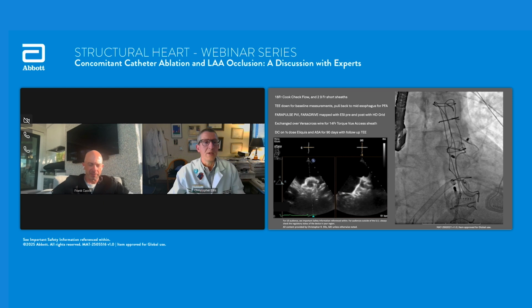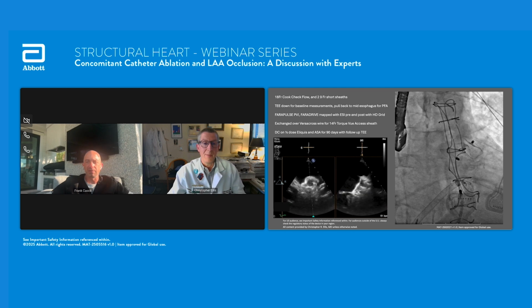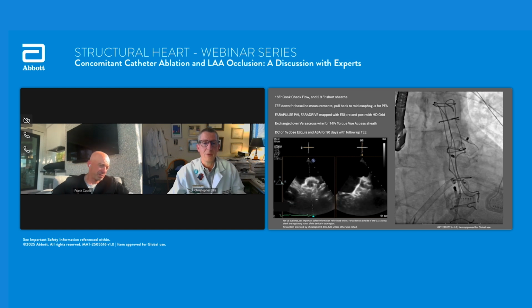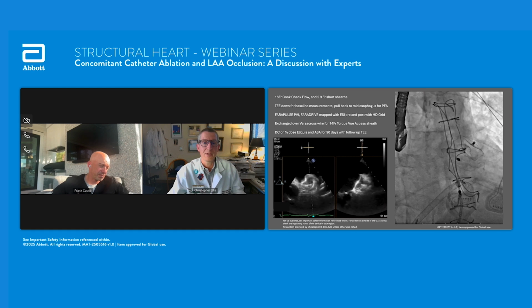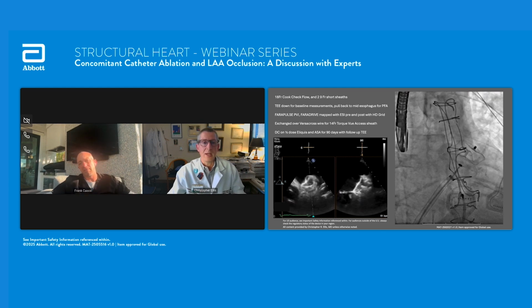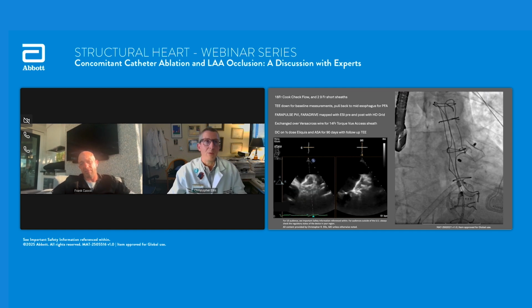I do really like the idea of getting all of the ablation done before you close the appendage. The big reason is, in my mind, let's say you work in the LA, you close the appendage, you go to the RA, and you get some ridiculous flutter that you have to cardiovert the patient for, and you've already released your appendage closure device. It's really not an ideal situation. You would like to complete the procedure by closing the appendage, reversing anticoagulation, and taking out all the sheaths. So I'll go back and forth at will.